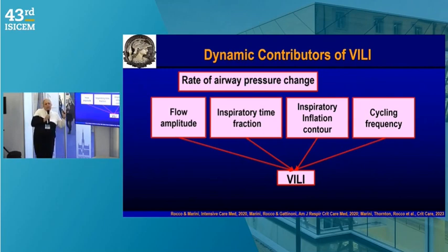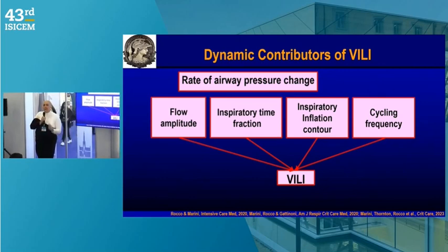I told yesterday about the importance of measuring the dynamic variables that induce VILI, because everybody thought that we have to focus only on tidal volume, PEEP, driving pressure, and plateau pressure. That's it. No, we have to focus on respiratory rate. We have to focus on inspiratory time. And the combination of all these factors may lead to the measurement of the mechanical power. Mechanical power is another variable that we have to compute at the bedside.